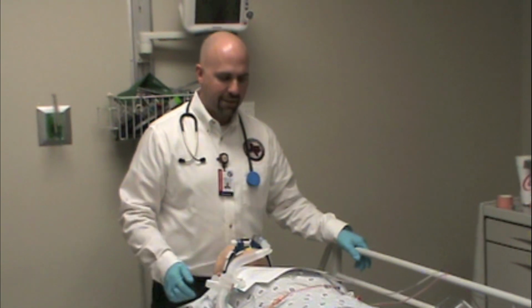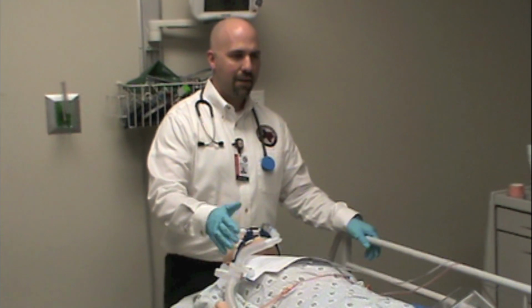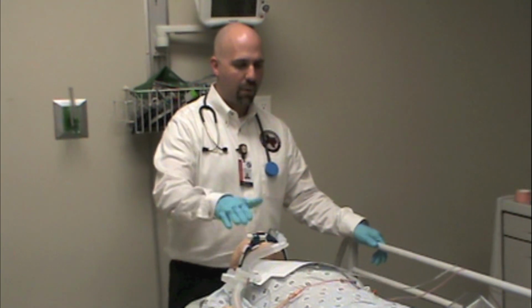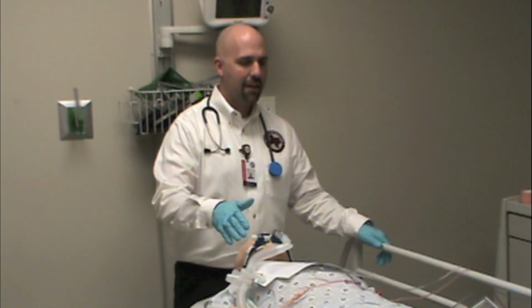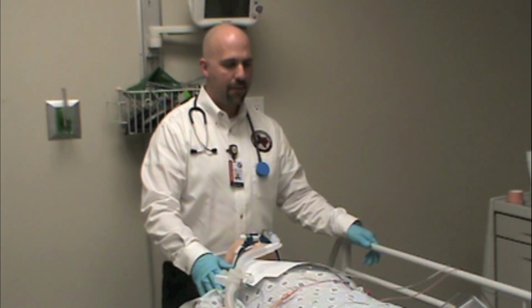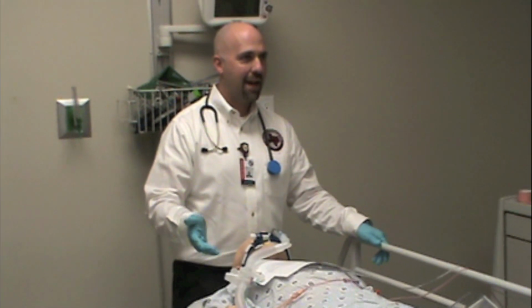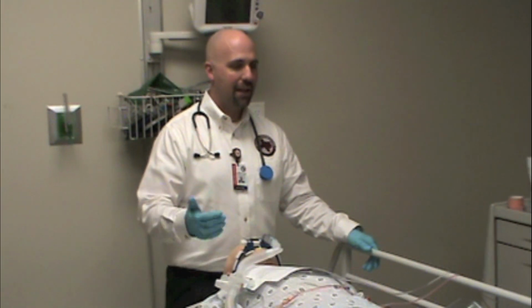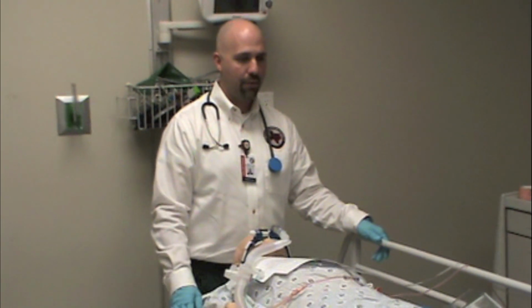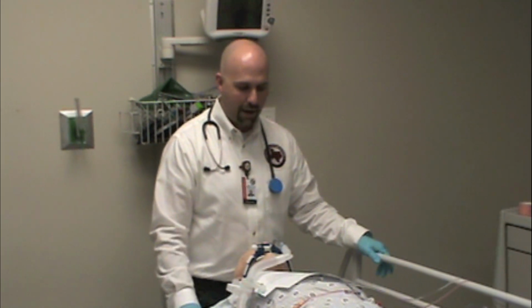The next thing is pneumothorax. If you have high pressure alarms on the ventilator and you don't have good lung sounds, then one of the things that you may have encountered is a patient developing a pneumothorax. So if you see one side of the chest rising and not the other side, that's an indication that it's either a pneumo or the tube is pushed too far down one side. If their vital signs start to change, they start dropping their blood pressure, they have poor O2 sats, they have poor end-tidal CO2, and they have no lung sounds on one side, that's a pretty clear indicator they probably are developing a tension pneumothorax. So you may have to reduce the pressure in their chest with a needle thoracostomy.